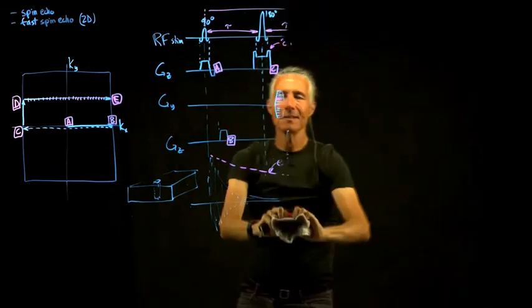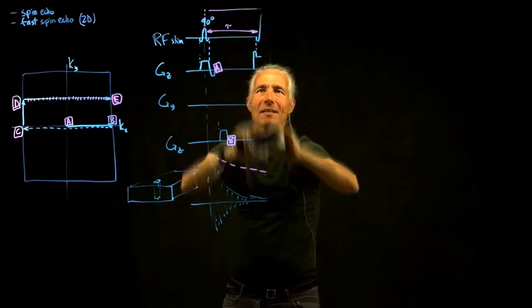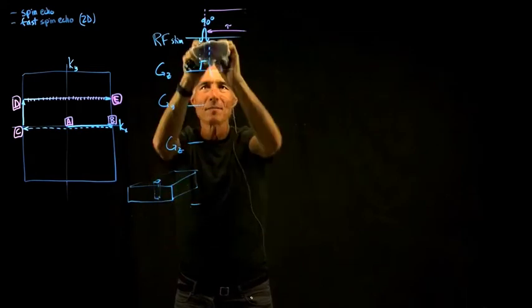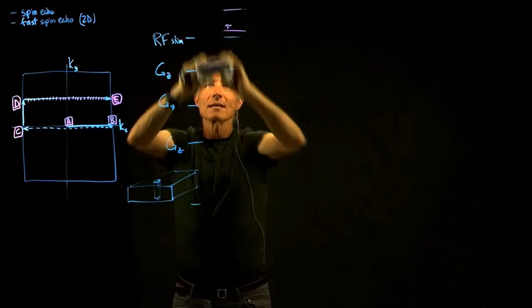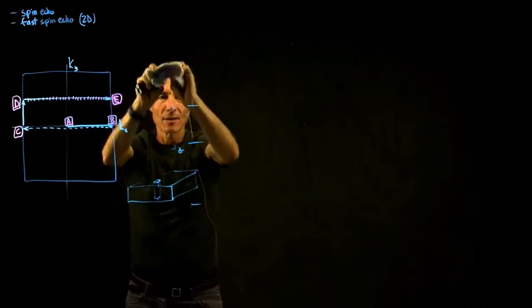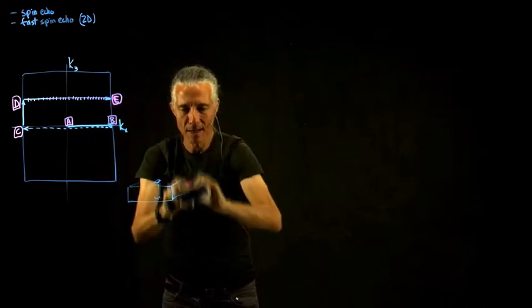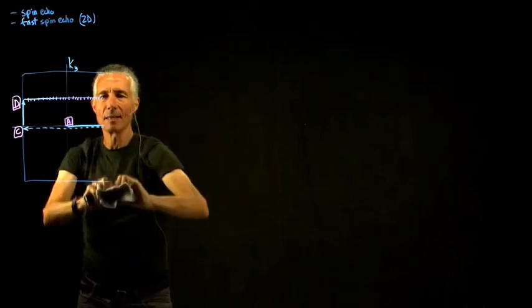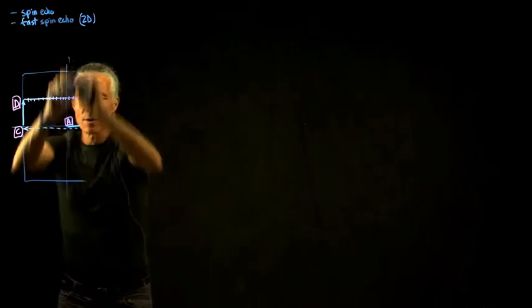That is not a good way to get good images. And so then people came up with an idea to essentially use a train of echoes. The idea here is that you're only recording one echo in this setup. Why don't we record a whole train of them?